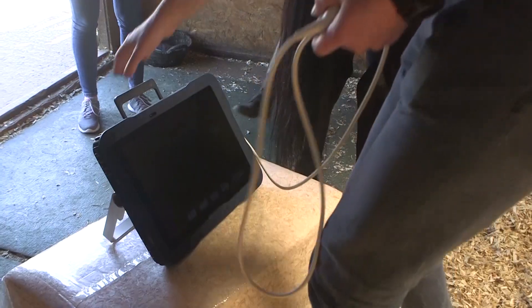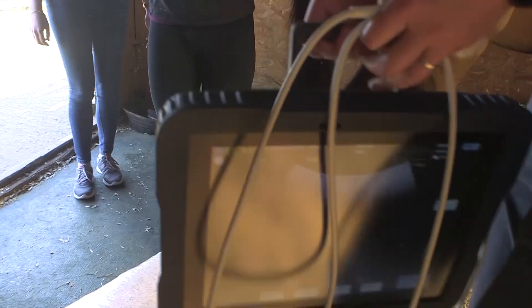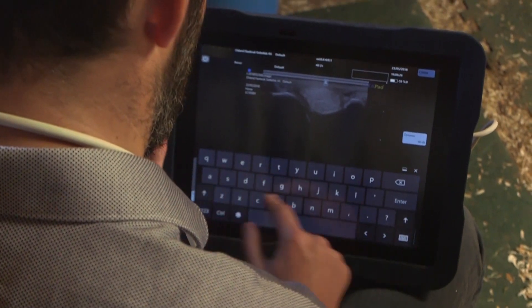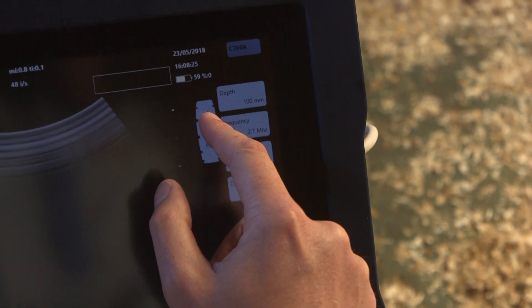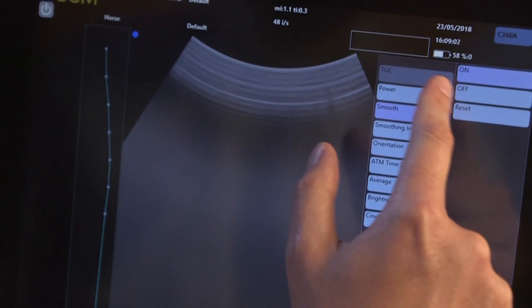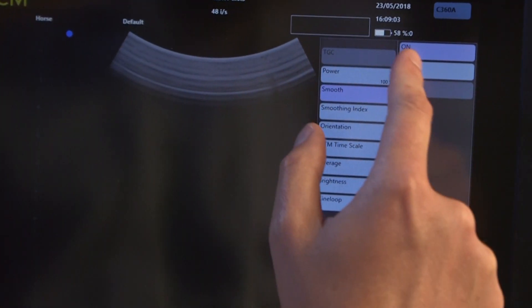The Exapad is designed to allow you to diagnose with confidence. With presets tailored specifically for vets, you can customize your scanner to your personal requirements, offering every user a simple and completely intuitive experience.